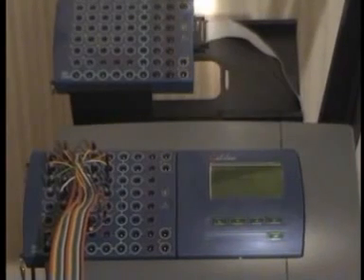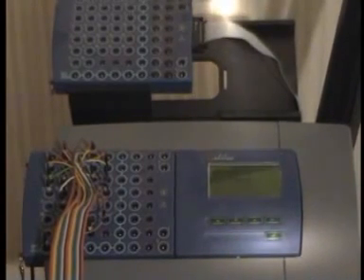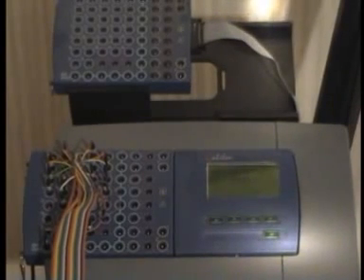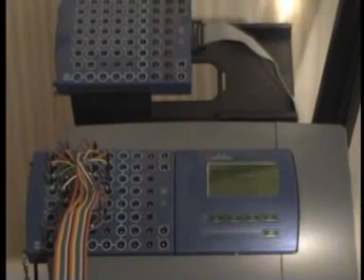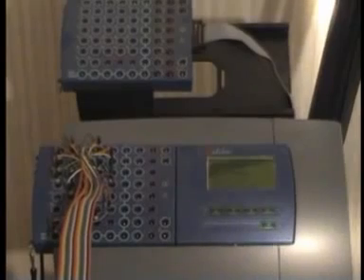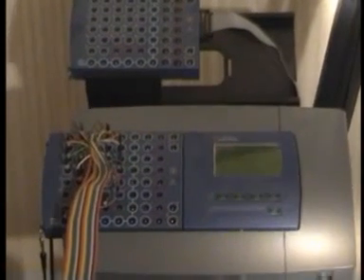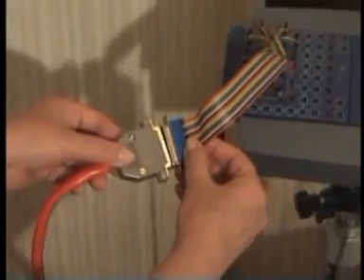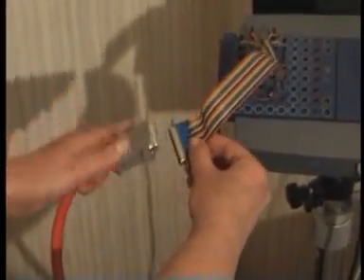It is important to emphasize that different EEG machine manufacturers have different ways of wiring electrodes through the connector. Therefore, it is important to know to which machine the COMBY EEG cap will be connected. If the adapter cable is being used, this information is not necessary.